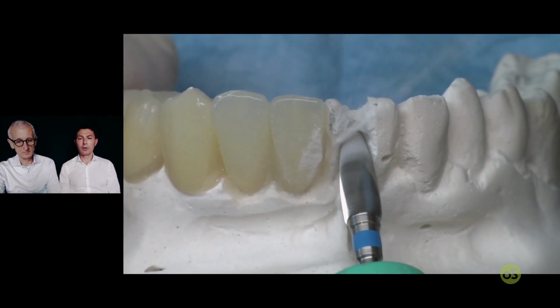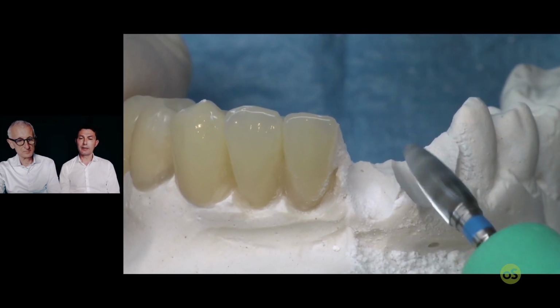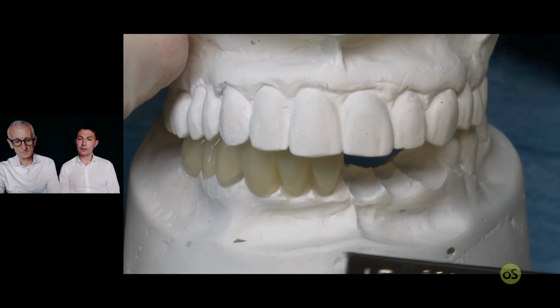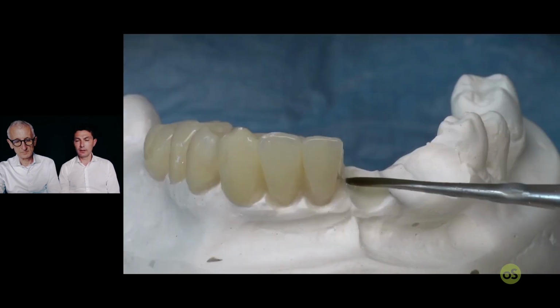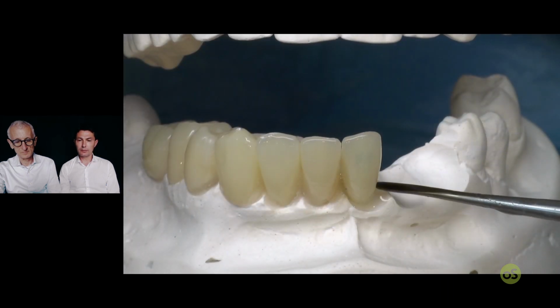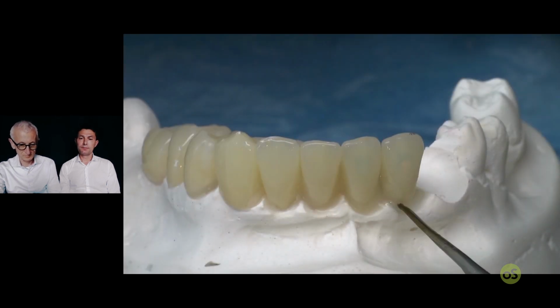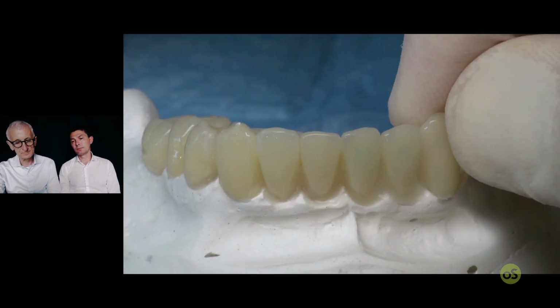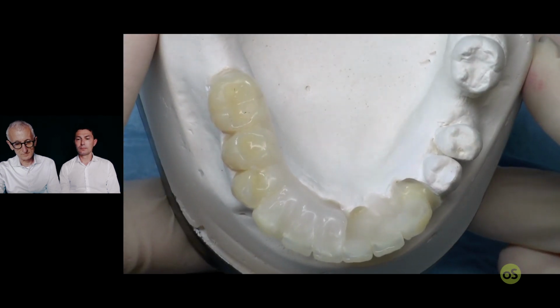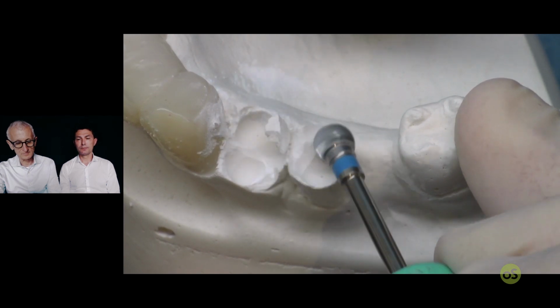And for sure it's only veneer and we need to shape the lingual surface, because this part is not in the restoration. On the other side, the same approach: first the incisor, the cuspid, and the posterior.